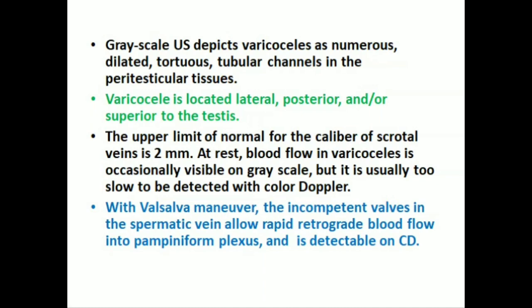Grayscale ultrasound depicts varicocele as numerous dilated tortuous tubular channels in the peritesticular tissues. Varicocele is located lateral, posterior, and/or superior to the testis. The upper limit of normal for the caliber of the scrotal veins is two millimeters.